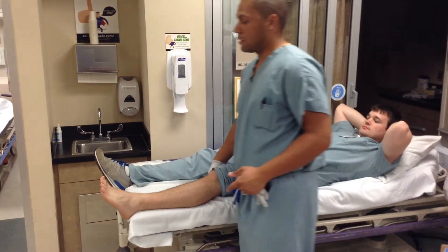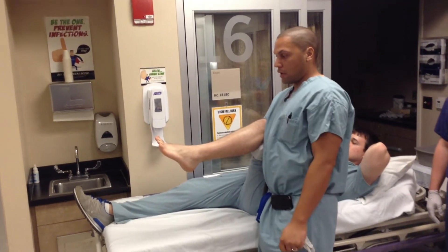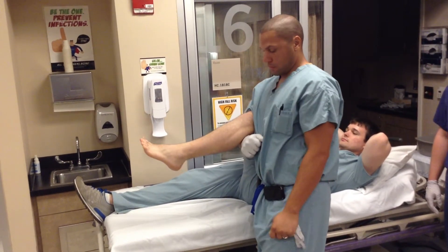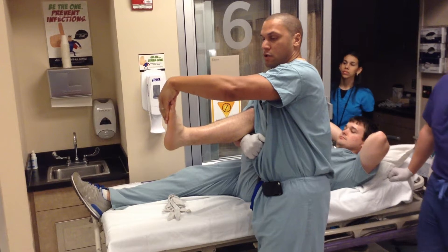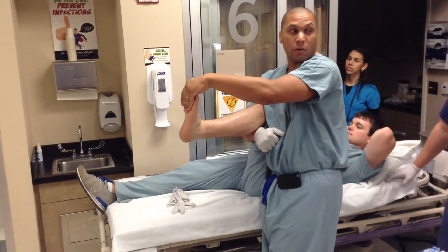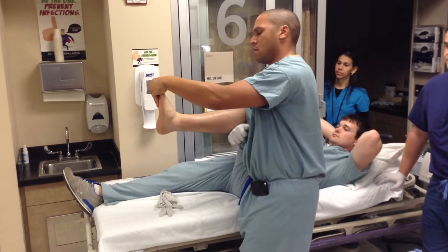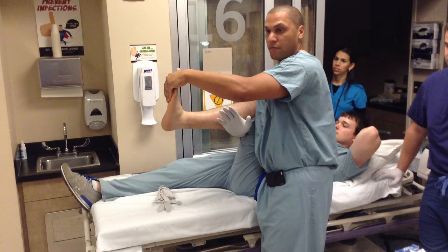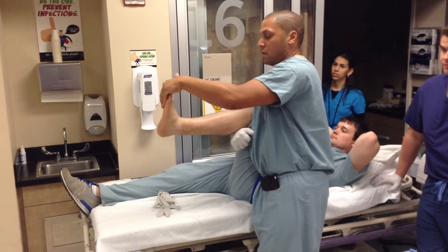I always say you're supposed to ski on the patient — get under them, lean back, and use your body weight to hold their legs. Get one arm underneath and hold them, put your hand on their toes. You can hold them back to 90 degrees, which is very important. If you let them go and they're in this for two weeks, they're going to get a contracture and then we have to fight with them in physical therapy. So get them 90 degrees at their knee, 90 degrees at their ankle, and hold them there. If you don't move for the splinter, they're going to splint around you.